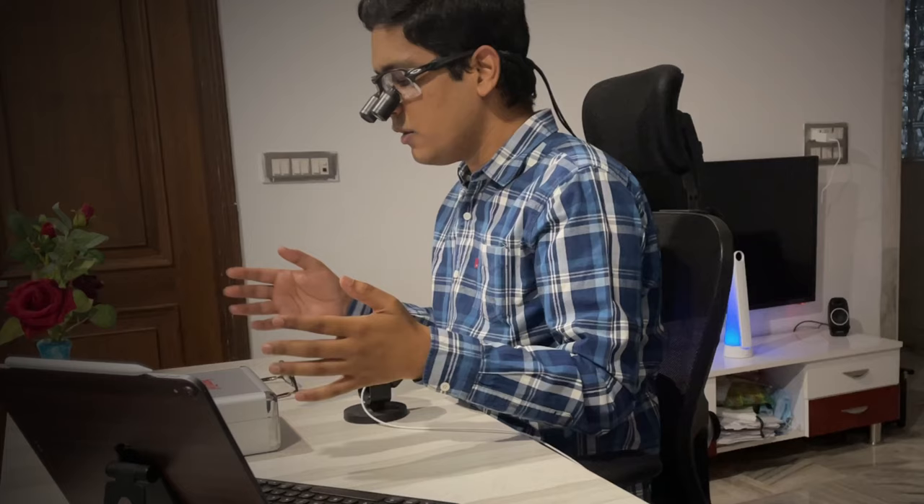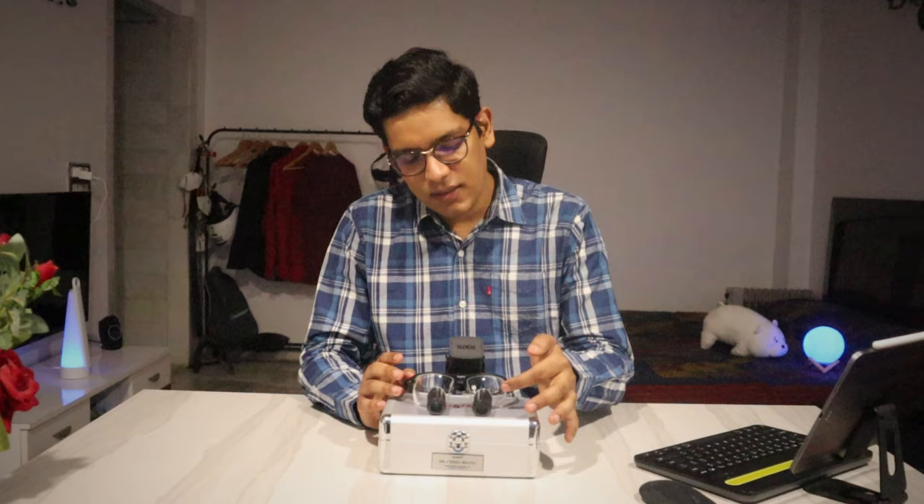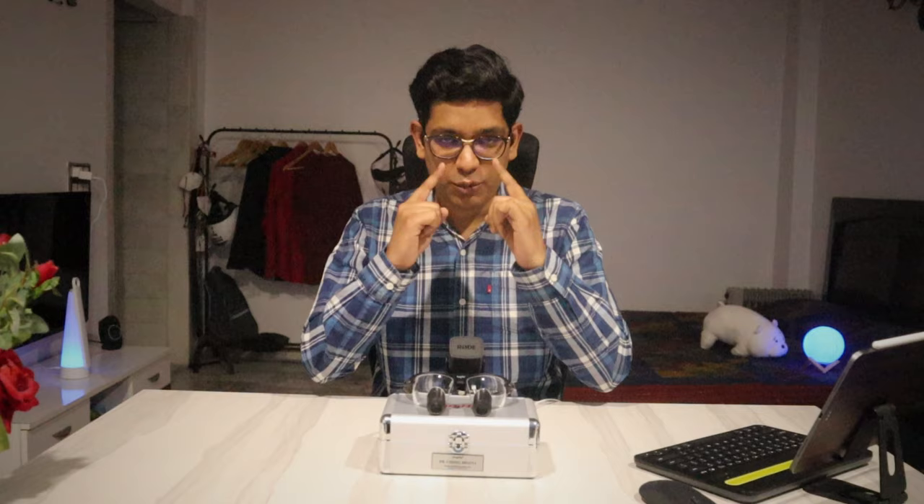So you get a wider field of view and it feels a little more natural. Talking about the specifications, this is a 4.5x magnification loop. The lens in the loop as well as in the glasses has been made as per my refractive correction. It's completely customized to suit my operating position. Measurements were taken for my height, my facial structure, my sitting position on the operating table, the working distance, the distance between my eyes and the operating table, and the interpupillary distance — the distance between my two pupils. All these measurements were taken and a customized loop is made so that I feel maximum comfort when operating.